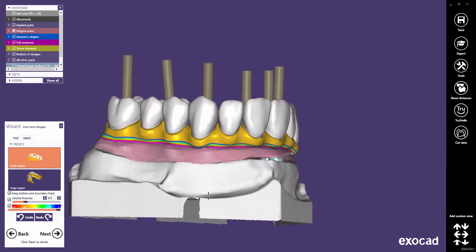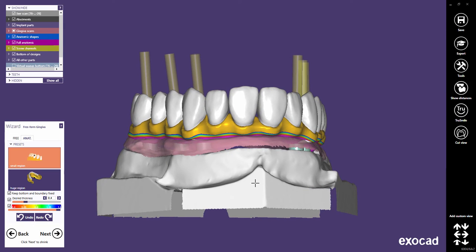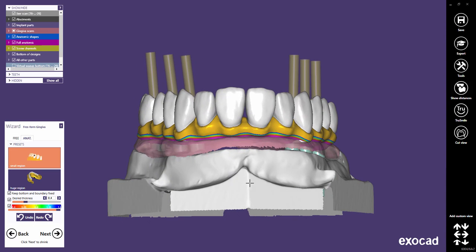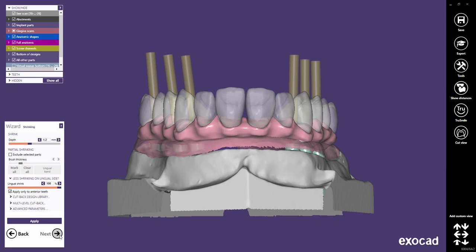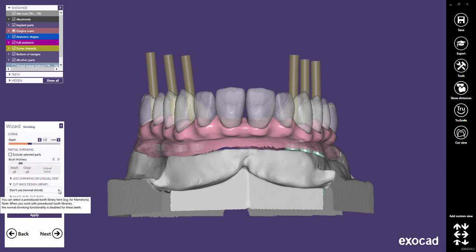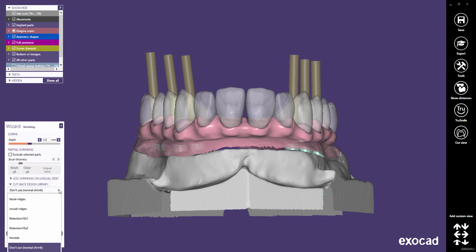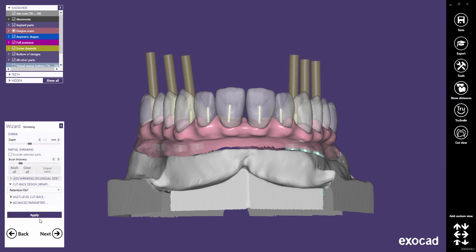Then proceed to the gingiva design step. This step can be skipped as the gingiva will be shrunk later. We directly proceed to the shrinking of the anatomical teeth. In this important step, you can now select between different cutback libraries. Let's try the retentions with 1 mm diameter. You will find more general information about all cutback libraries in a separate video tutorial.